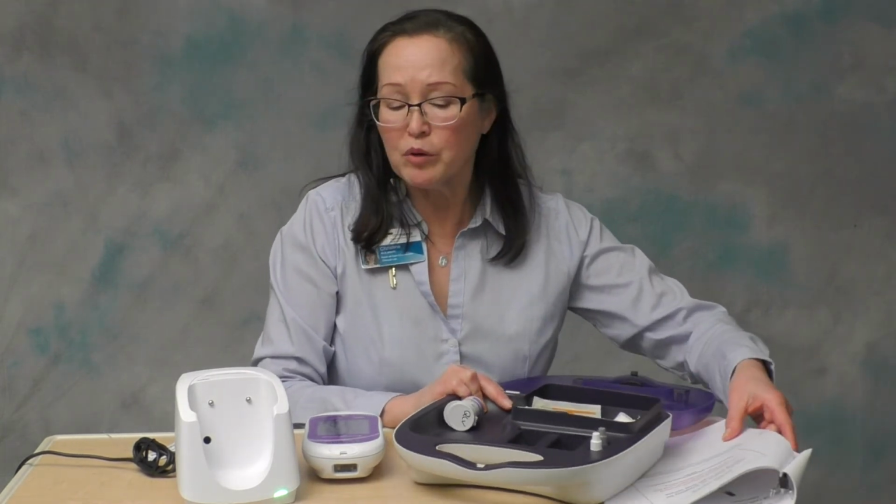All right, so now we're going to move on to patient testing. And just because I think that some HUCs may be accessing this video for their training in addition, patient testing is only performed by RNs, certified medical assistants, and ED techs. So if you are a HUC, you are allowed to do QC testing, but not patient testing.